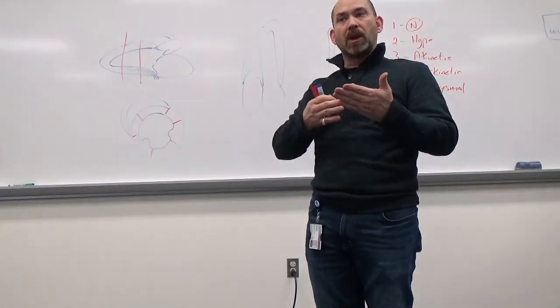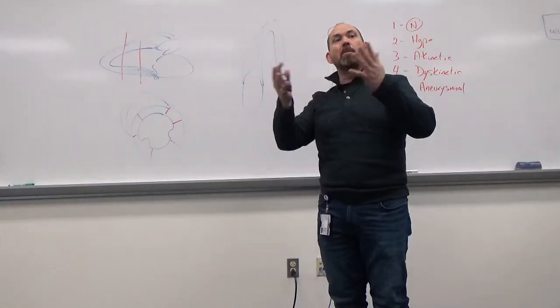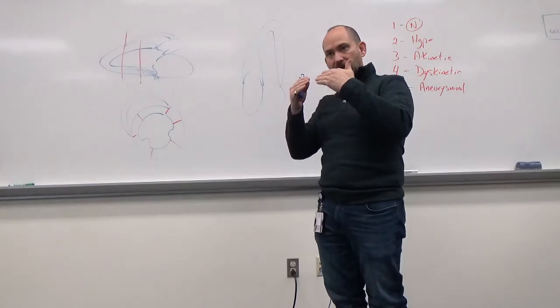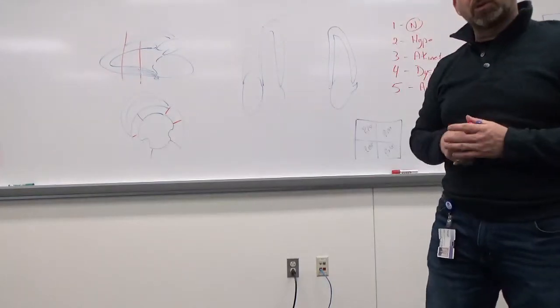Okay, so sometimes the leaflets don't open because it's not being pushed very much. So when we do the stress test, they actually start opening more than they were before. So we want to know if the valve itself is stenotic or if it's just low cardiac output that's not opening it enough. Okay, so we'll do exams for that type of purpose.